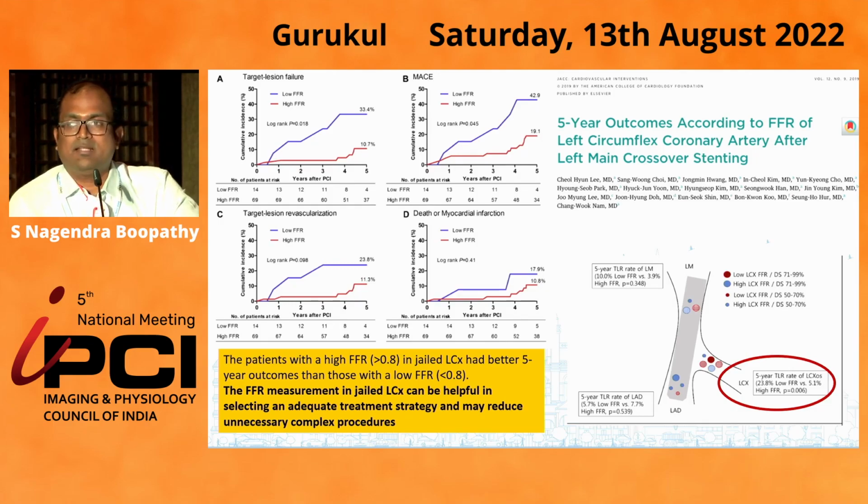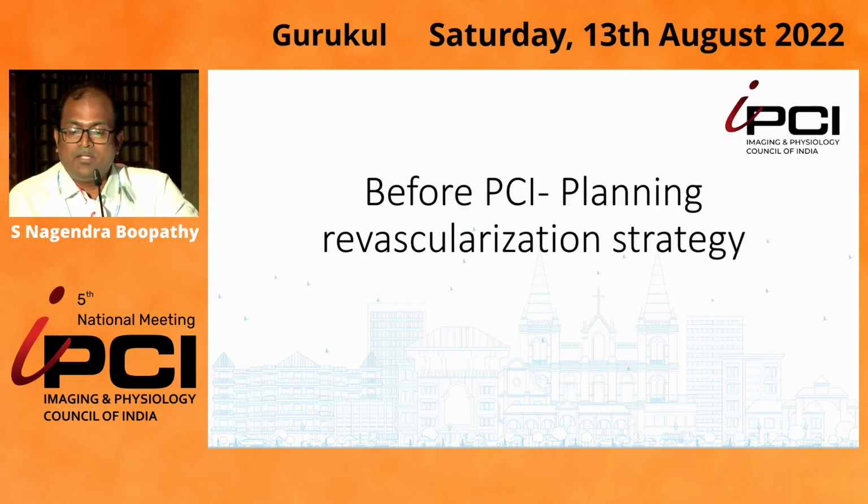So with FFR less than 0.8 in a single stent strategy in left main, try to intervene on that lesion. Don't leave the patient with an FFR less than 0.8, even without a plaque. That's a carinal shift, so it's causing significant hemodynamics.